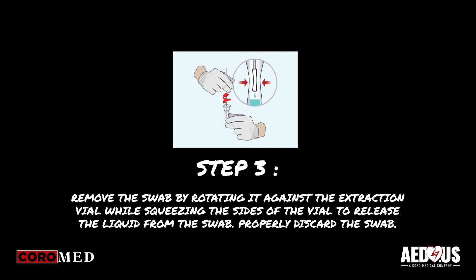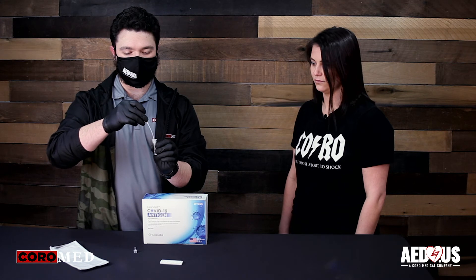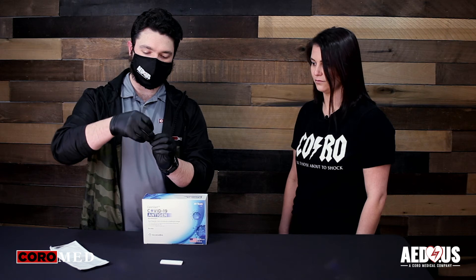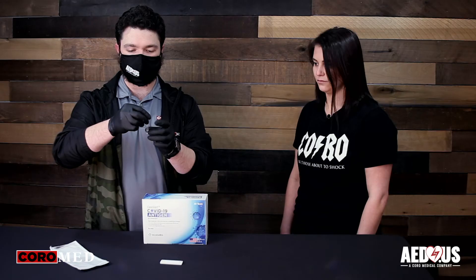Next, remove the swab by rotating against the extraction vial while squeezing the sides of the vial to release the liquid from the swab. Now, close the vial with the provided cap and push firmly onto the vial. Mix thoroughly by flicking the bottom of the tube.